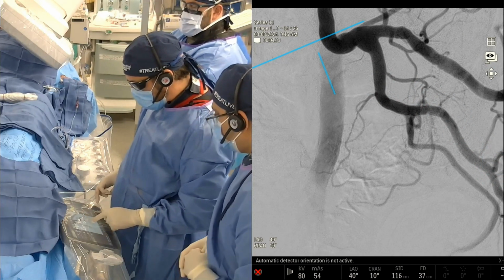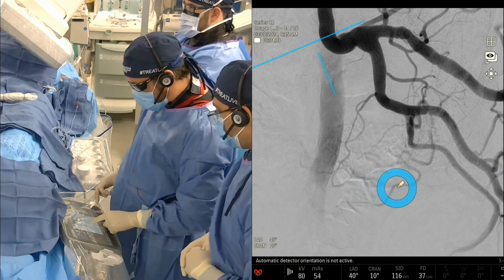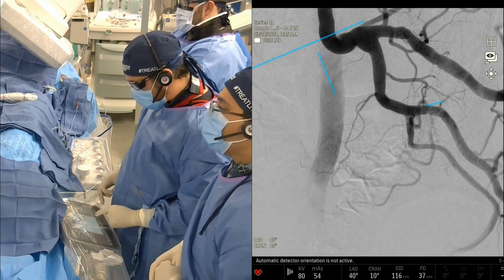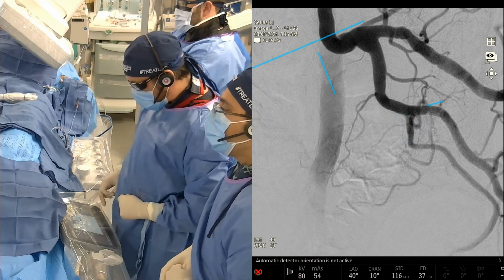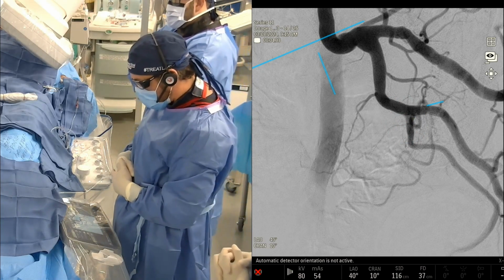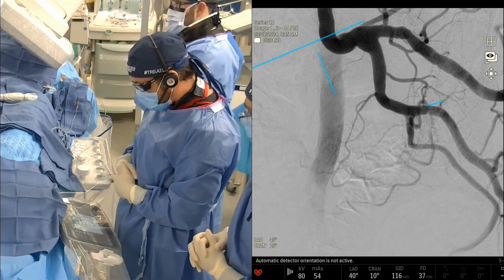And if you look closely, it looks like the prostate artery, which is this vessel here, we're going to trace it all the way back, originates off the side of the pudendal, which is right here. At least that's what I think based on this image. Do we all agree? Definitely. So this is a classic type 4 origin, although it's a little angulated.